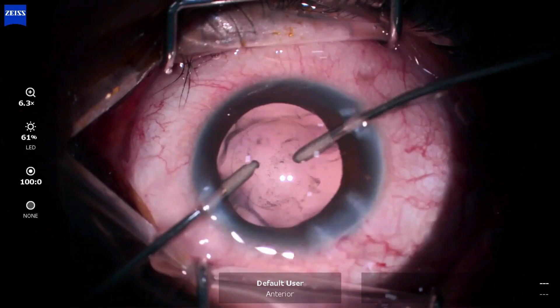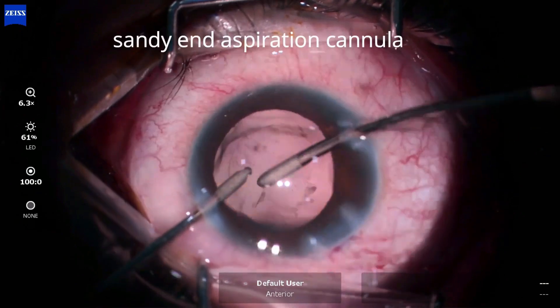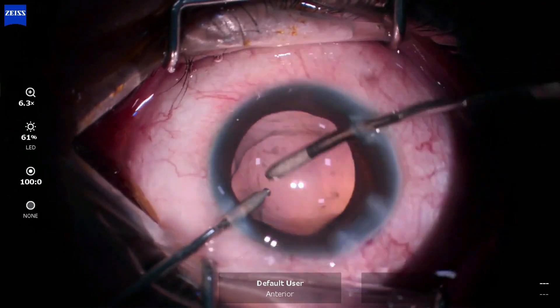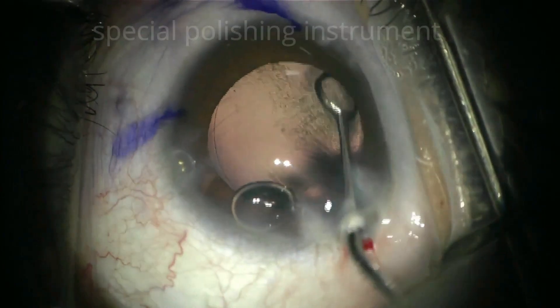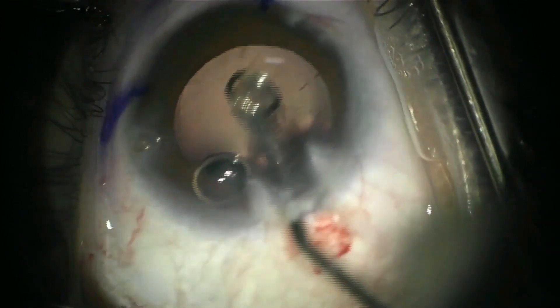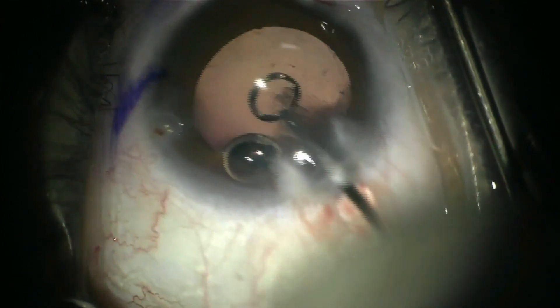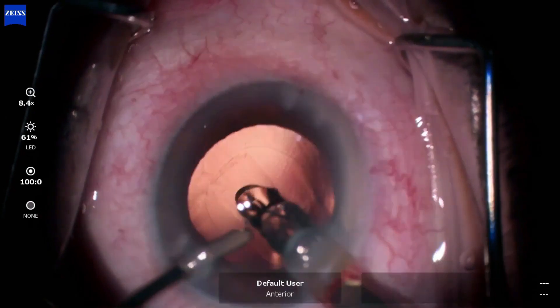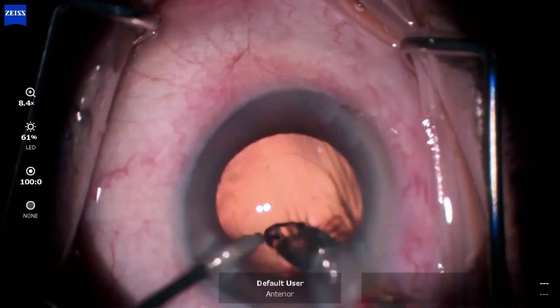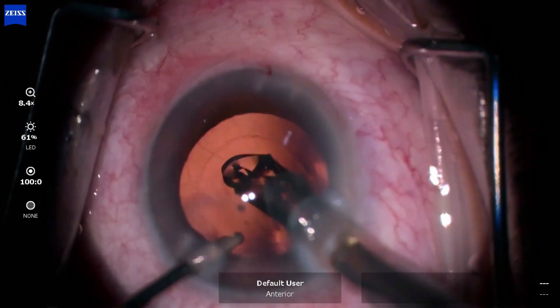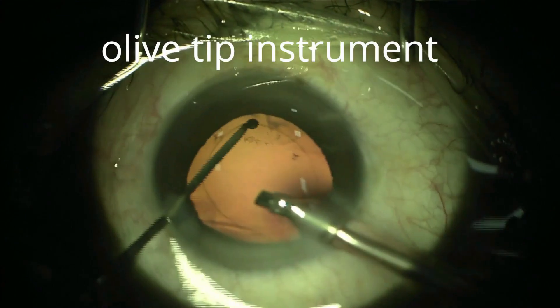Moderately adherent opacities require gentle polishing, which can be achieved using the sandy tip of the irrigation-aspiration cannula, a specialized polishing instrument, the optic edge of the intraocular lens, or the olive-tipped end of a smooth chopper.